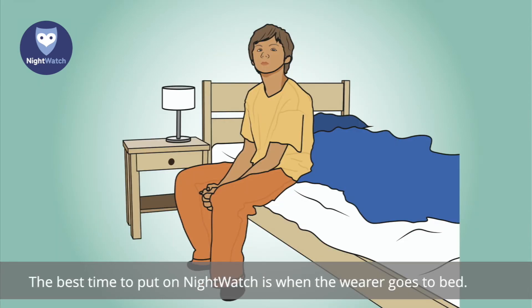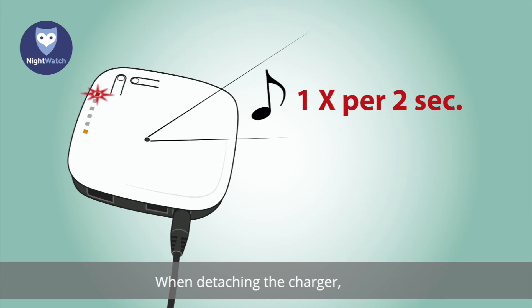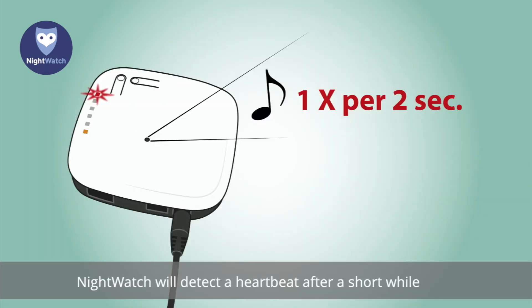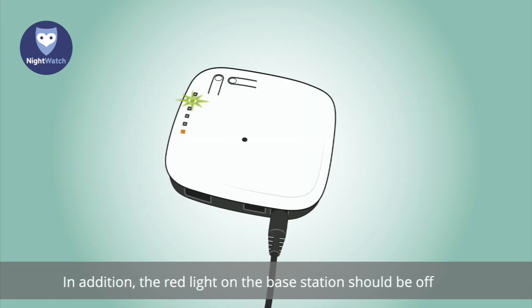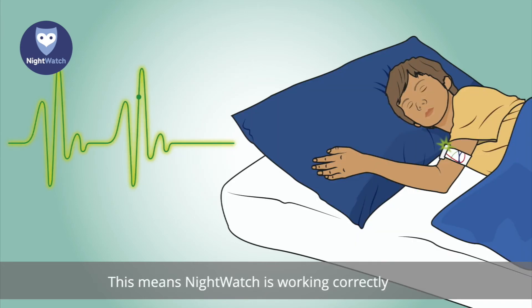The best time to put on Nightwatch is when the wearer goes to bed. Remove the arm module from the charger. When detaching the charger, you will hear a beep every two seconds and see a blinking red light on the base station. This means the arm module and base station are connected but no heartbeat has been detected yet. Place the arm module around the upper arm. Nightwatch will detect a heartbeat after a short while and the beeping will stop. The red light on the base station should then be off and a green light should be visible, meaning Nightwatch is working correctly and the wearer can go to sleep.